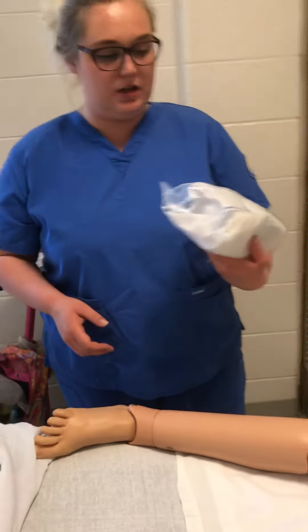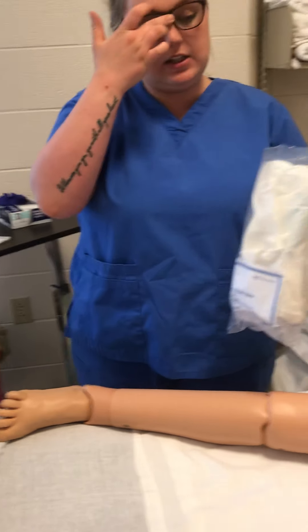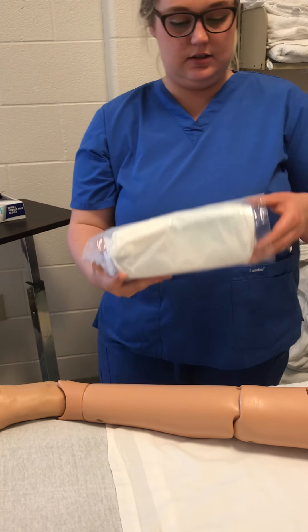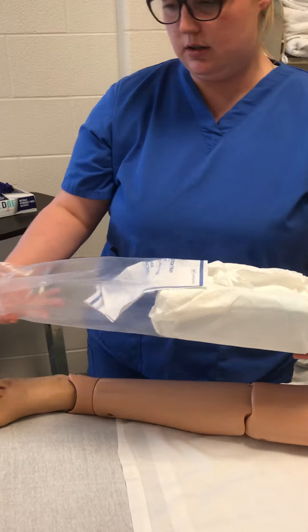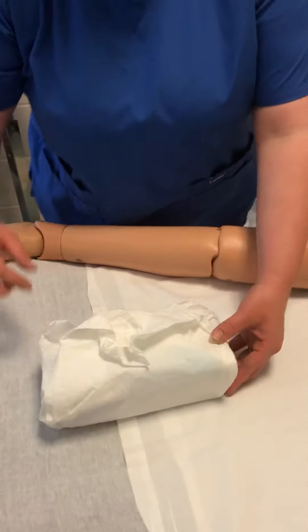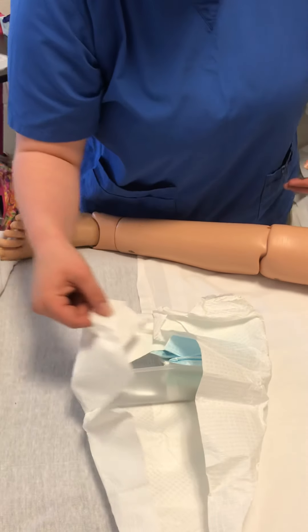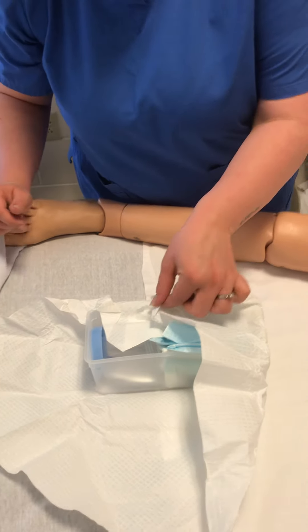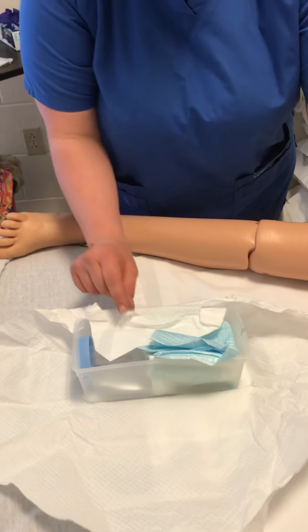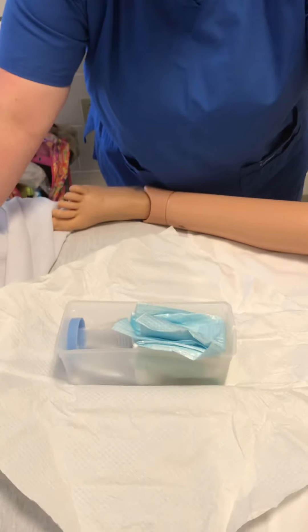Now I'm going to open my straight cath tray. I'm going to make sure it's all intact — and it's all intact. I'm going to pull it out and smooth it down just a little.